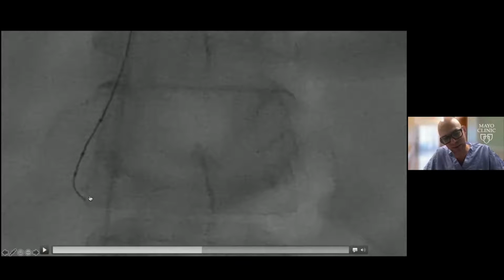And this is something I just want to point out. When the wire goes medial, then you're at the spot. So this is like the pedicle right here. The wire going medial means that the microcatheter is basically in the foraminal vein. So now I have my microcatheter here. My wire is going medial, so I know that I'm pretty much where I want to be.